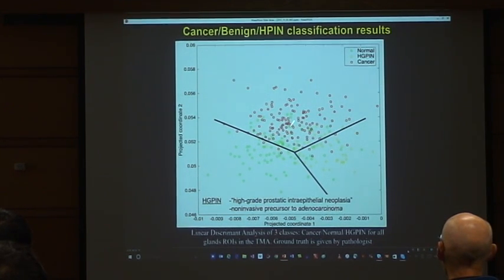So at least between normal and cancer, I think this could be, as I said, somewhere around 80% accuracy to just screen through most of the cases and refer the complicated ones to the human, to the pathologist. Okay, so this is where we are. As I said, we're learning that it's a lot harder to publish in these clinical journals when you have to image hundreds and hundreds of samples.